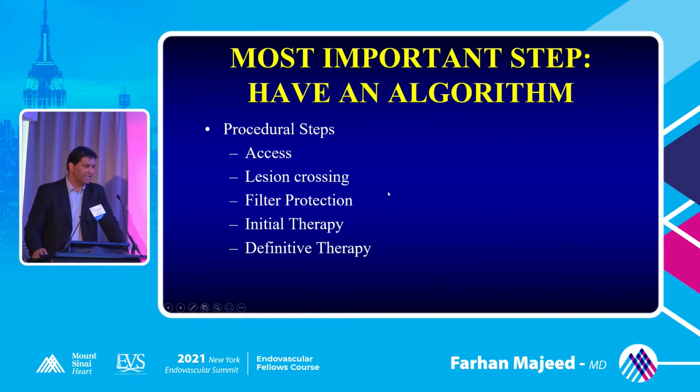Anybody want to do thrombectomy in this? Considering we heard that most of these in-stent restenotic lesions have some level of thrombus. You want to do thrombectomy? Yeah. So, okay, good. All right, okay, so that's our initial therapy, and then definitive therapy we'll talk about.